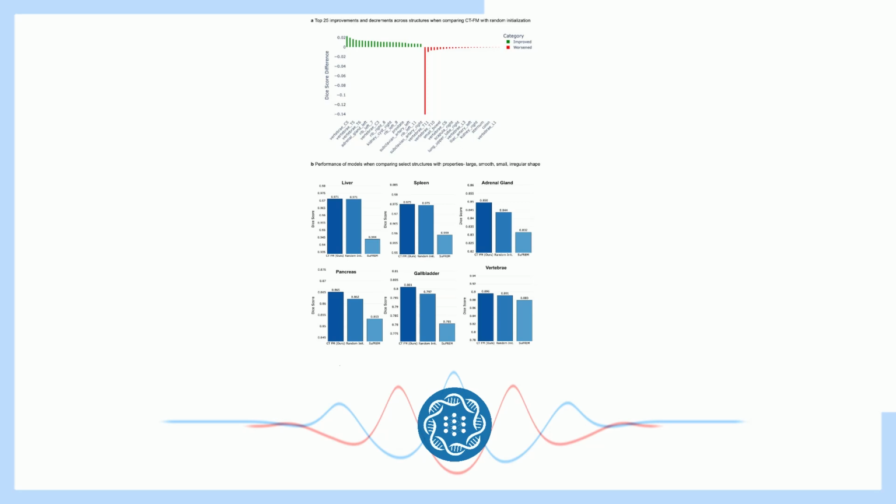Absolutely. And then there's the ever-present challenge of AI security, particularly the risk of adversarial attacks. Adversarial attacks, those sound a bit ominous. What are those? It's a bit technical, but basically imagine someone intentionally manipulating the input data, the CT scans in this case, to try to trick the AI into making incorrect predictions or classifications.